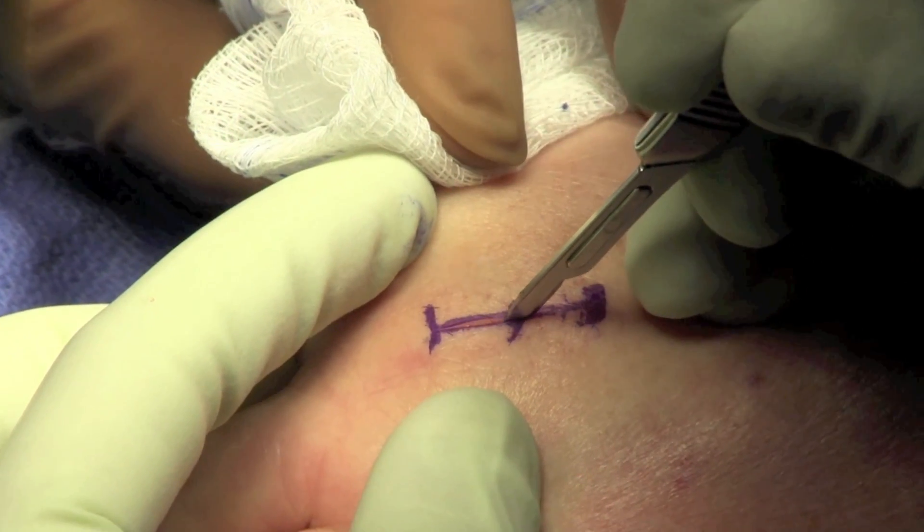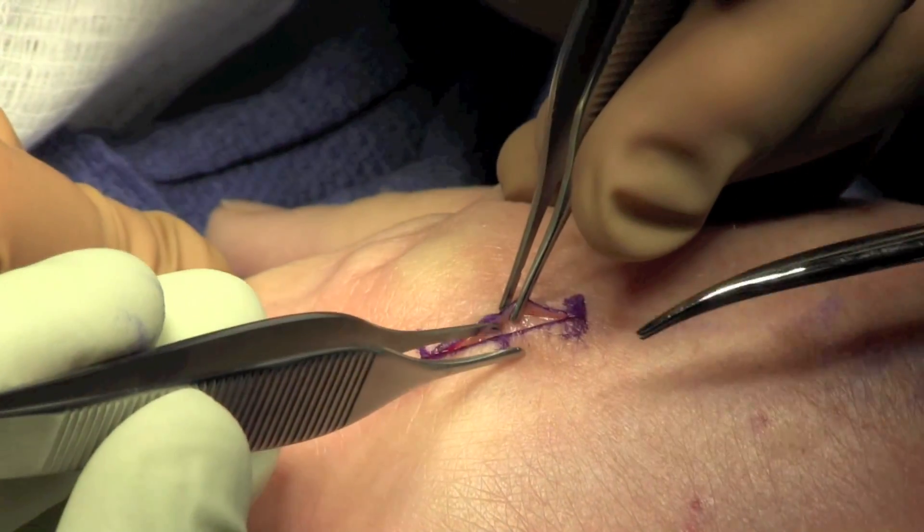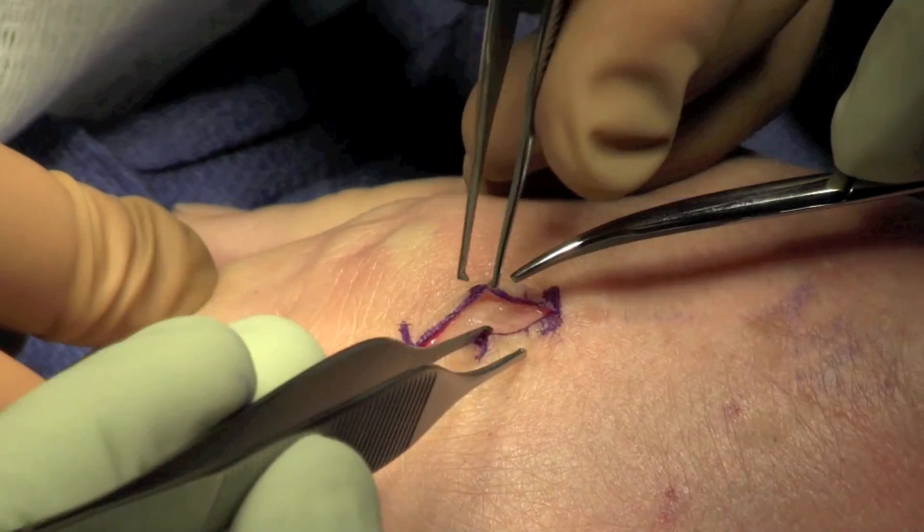An incision is made directly over the mass. Dissection is carried out, taking care to preserve any cutaneous nerves.